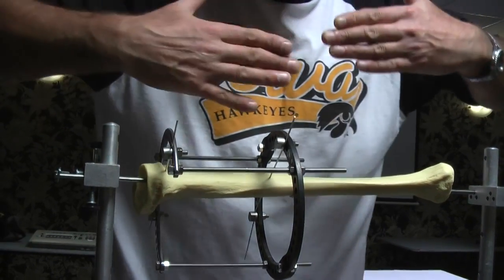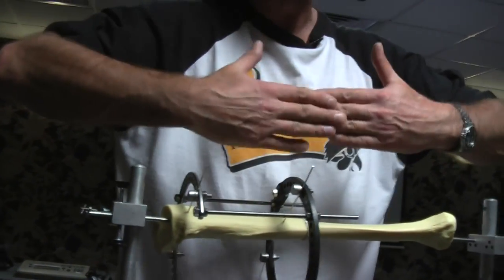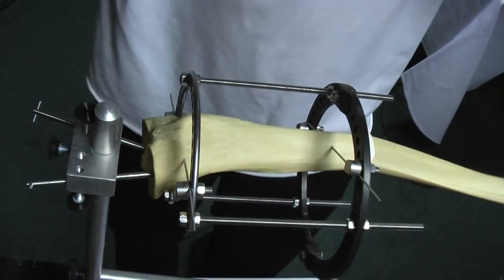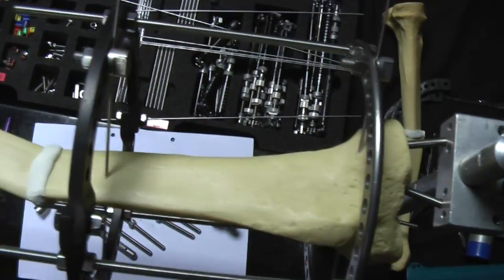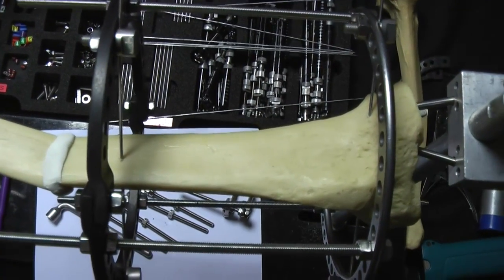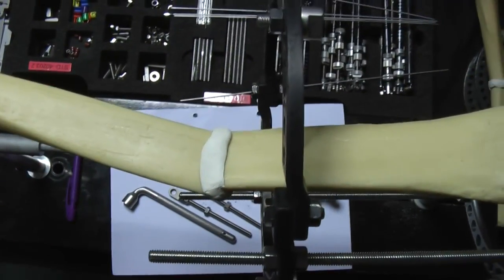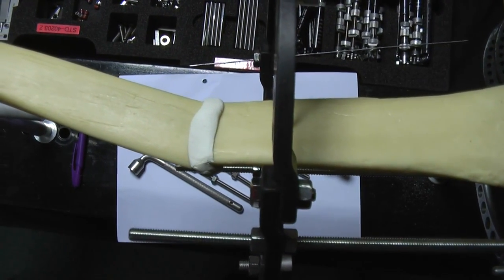Therefore, if I stand here and do an AP, which I can, I should now be looking into the maximum deformity. Now, remember we said earlier, when we're doing hinges and osteotomy rules, work out where you want the hinges to be in relationship to the bone you're cutting, to the wedge. If you put them right on the convex border, the bone will come straight and not lengthen. If you put them away from the convex border, the bone will straighten and lengthen. And if you put them in the bone or on the concave side, basically you'll have to compress things to get it straight. We all agreed?